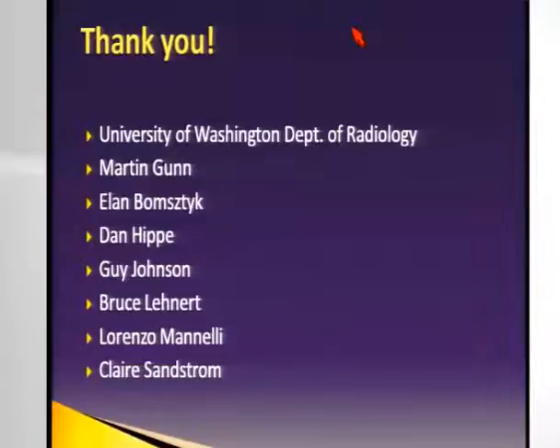Yes, sir. Do you measure the threshold Hounsfield unit for contrast CT exams for intramural hemorrhage? We didn't measure the Hounsfield units of the aorta when putting together the study. The reviewers may have measured the Hounsfield units of the aorta, because, I didn't mention this here, but all of the cases were de-identified and put on PACS for PACS image review. So they had the full range of the PACS tools.